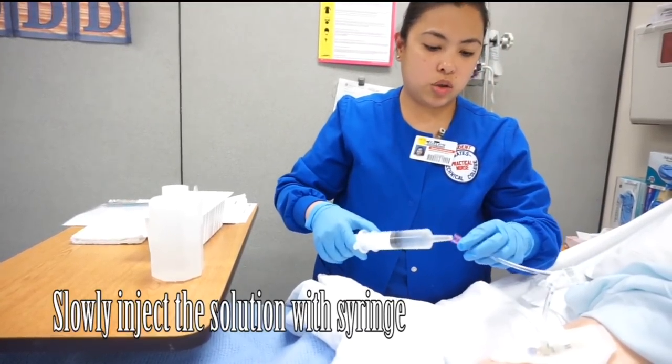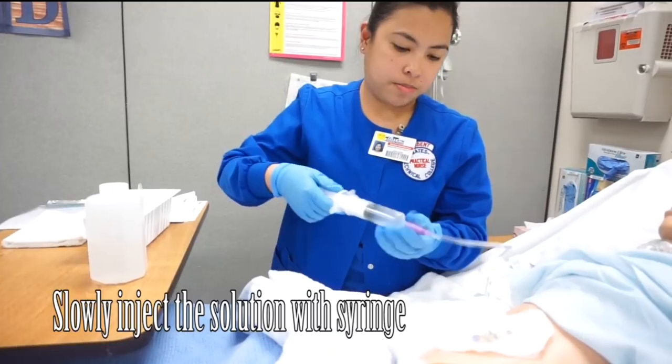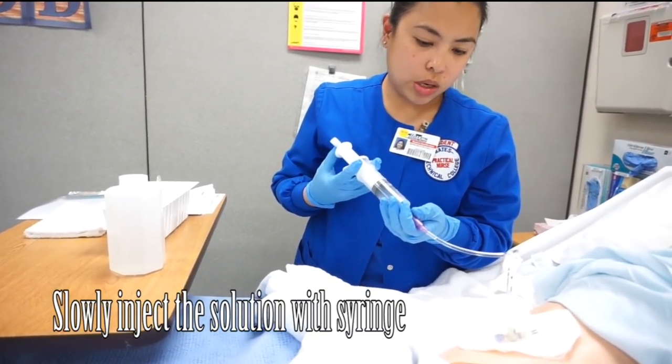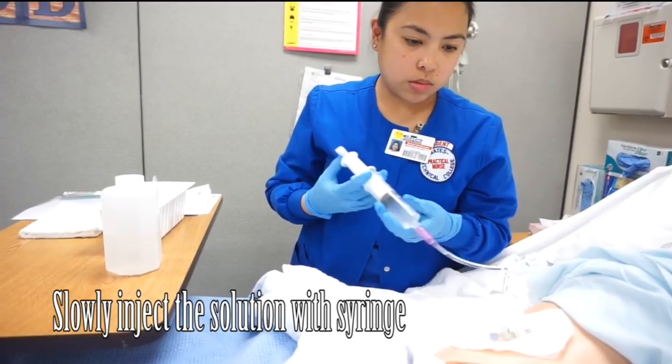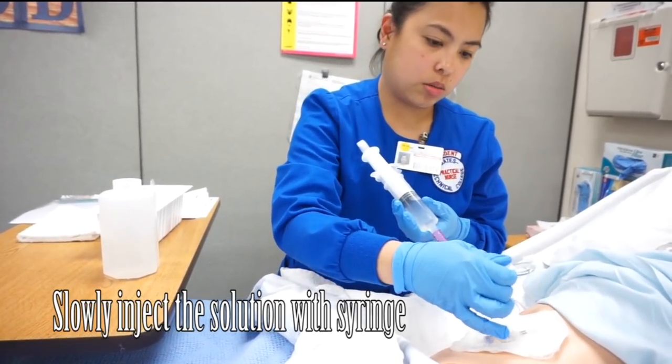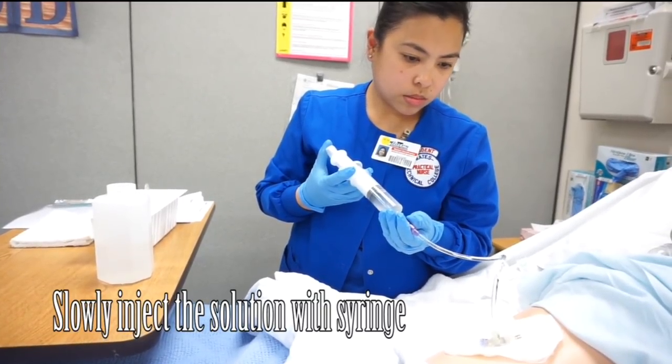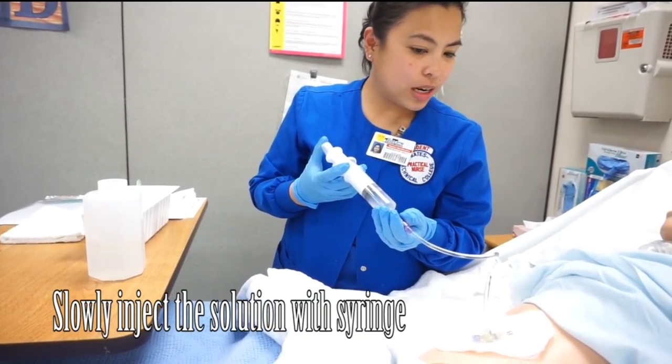Now I'm going to irrigate the tube and put the fluid in slowly. Don't forget to unlock it — I'm going to unlock this one first. How are you doing? Feeling good?